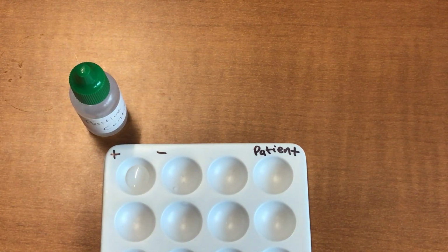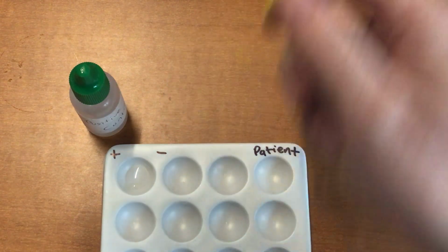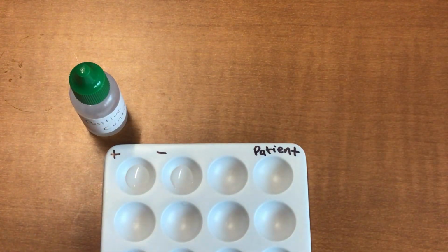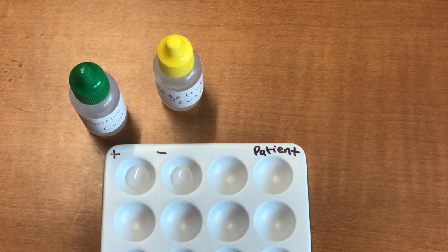And then you're going to get a sample that does not contain the disease you're looking for. So a negative control, someone who does not have salmonella. You're going to pour 3 or 4 or 5 drops into the negative. So just as a review, in this first cup, that's salmonella in there. And this second cup, that is not salmonella, or whatever disease you particularly want to test for.